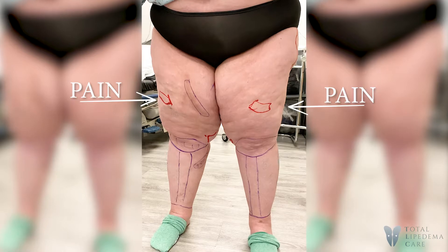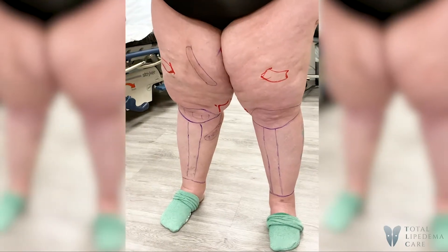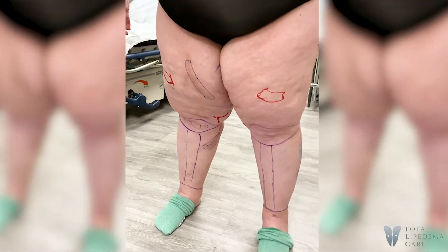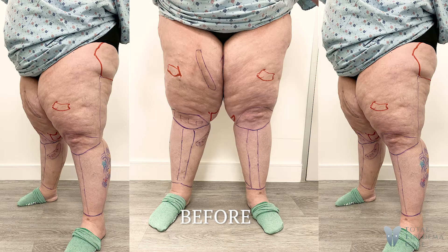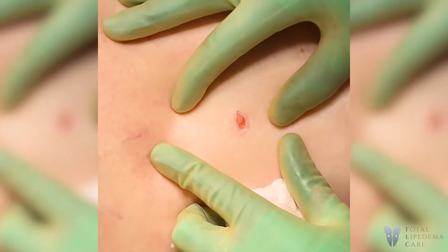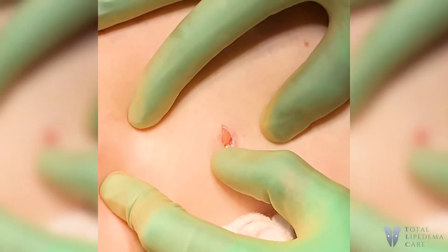Which is actually a good thing for us. As we were talking, you said you can probably right now do about half a mile before your legs start. So this will be interesting to see. We just made an incision and just started putting the fluid in.